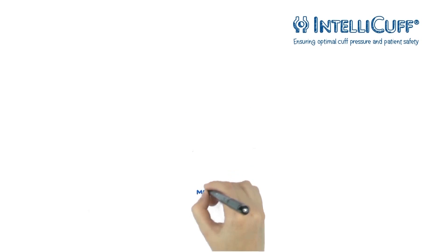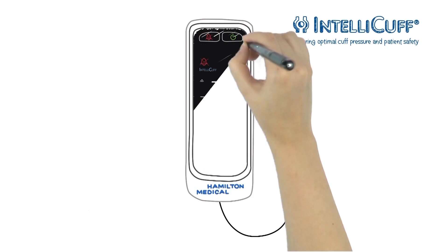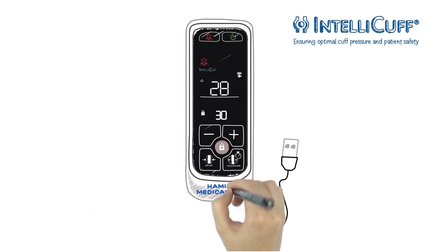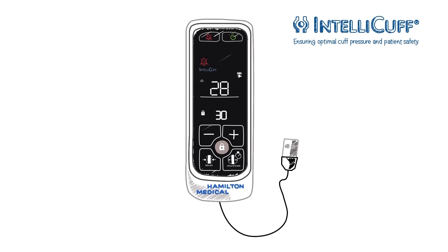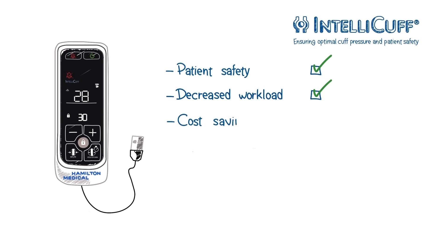Here you can see the Hamilton Medical IntelliCuff pressure controller. By ensuring an optimal cuff pressure, IntelliCuff helps to decrease the risk of ventilator-associated pneumonia and tracheal injuries. Your benefits? Increased patient safety and decreased workload with subsequent cost savings.